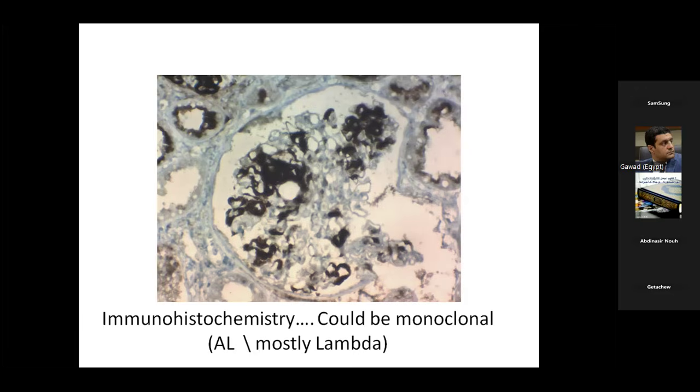Of course, amyloidosis under electron microscope has a characteristic feature of fibrillary deposits with a certain diameter to be measured, but actually electron microscope is not a diagnostic tool for amyloidosis. Amyloid is diagnosed mainly by its PAS negativity and its Congo red positivity, and its immunophenotyping by immunohistochemistry is very important. And later with next slides, we'll see what else could be fibrillary under electron microscope.